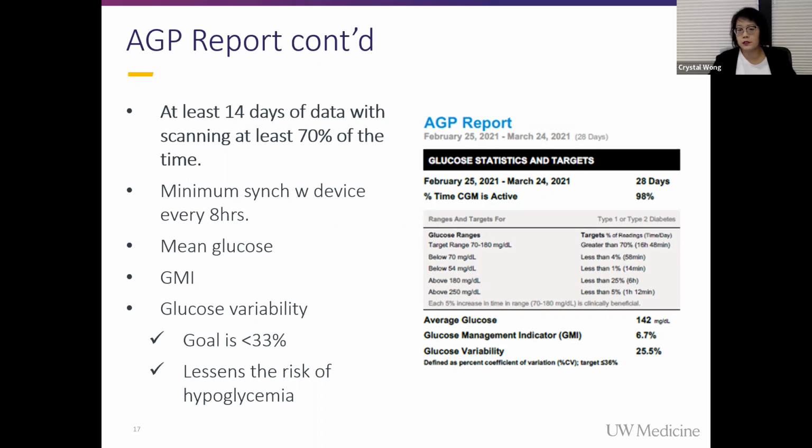So that's $25 a sensor. You might have patients who are just very interested, maybe their insurance wouldn't cover it otherwise, and they just want to do it for 6 weeks, and they're willing to pay for 3 sensors just to get that information. So again, I think it's more about programmatic fit, and then we can figure out the cost of sensors.